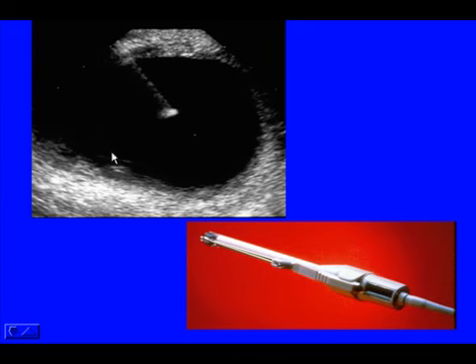Patients usually get immediate relief from the pain. The procedure is not painful. Occasionally I will place a little lidocaine in the vaginal vault, but if there's no inflammation, there's probably no need for lidocaine.